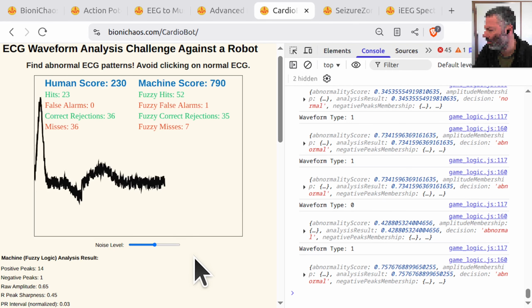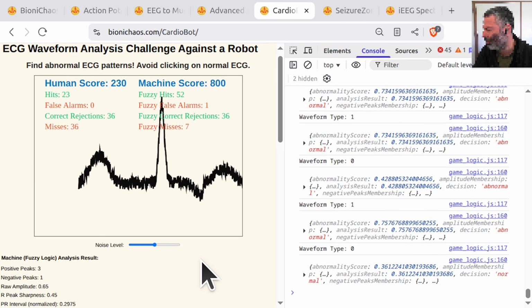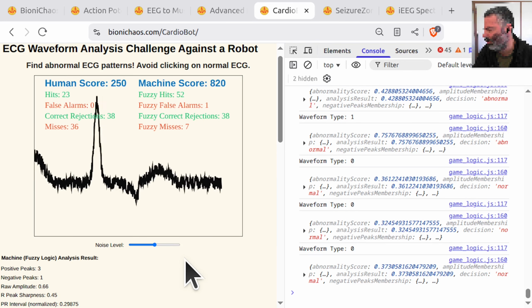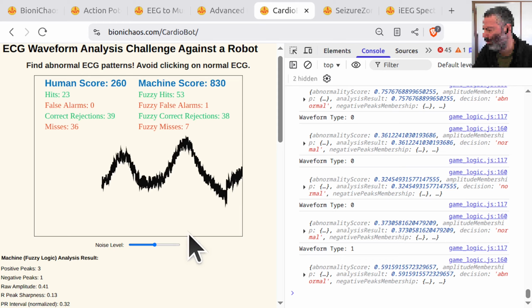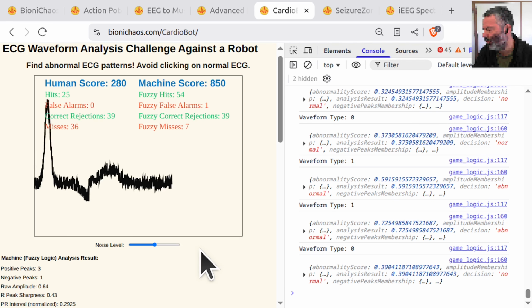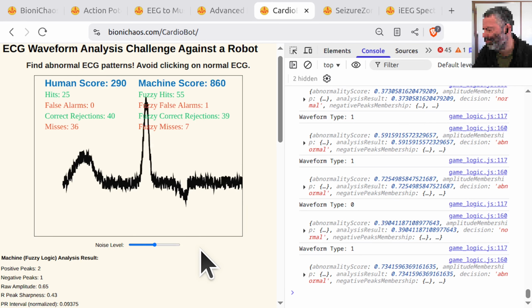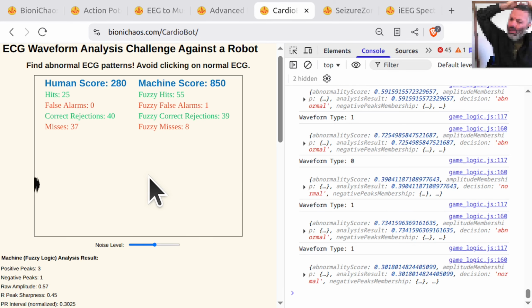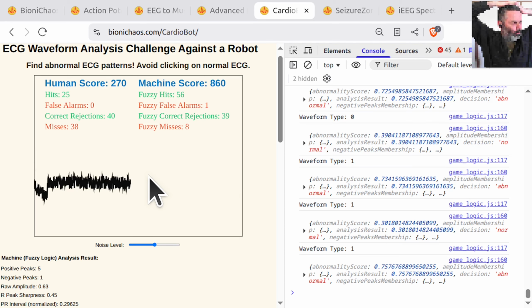What about the shape of the mountain? That's the second clue. R-peak sharpness. This is a clever metric. It calculates the width of the R-peak at half its maximum height. A wide peak or a low sharpness score suggests a problem with the ventricular depolarization, a key sign of several serious arrhythmias. It's measuring the pointiness of the most important spike. The pointiness score, I love it.